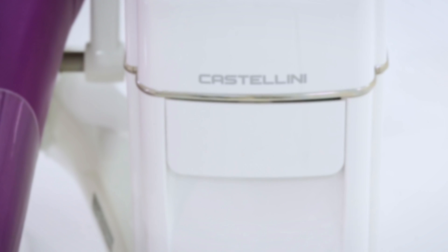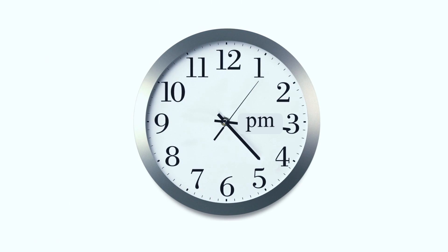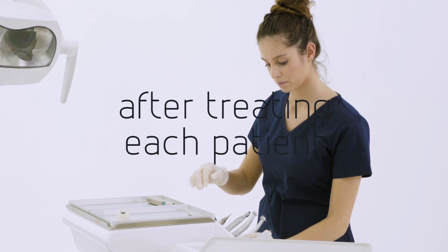Castellini has always designed solutions and recommended procedures to ensure the highest hygiene standards in dental surgeries. Each procedure is designed for a specific time of day.